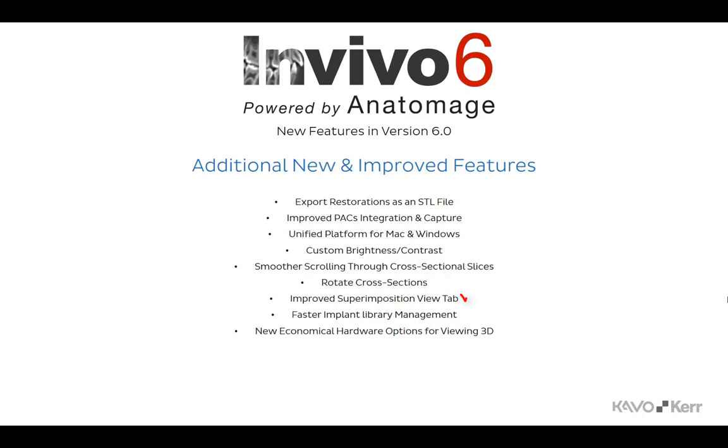The Superimposition View tab now allows for more than one pair of scans to be loaded simultaneously for comparison purposes. New to the software are tools to download implant library updates directly from the Invivo 6 user interface.